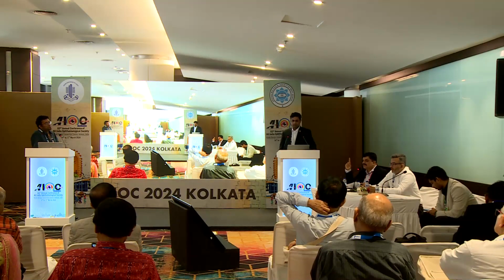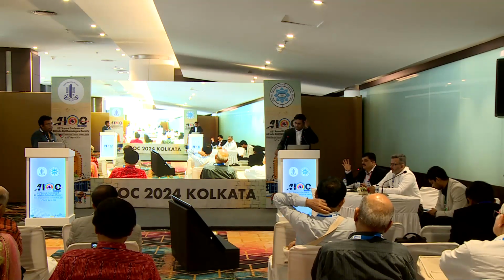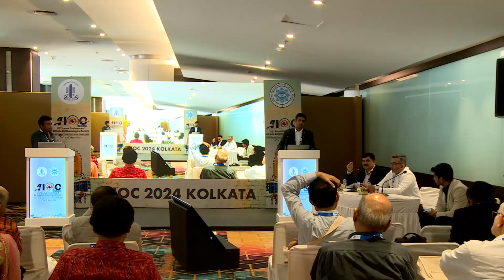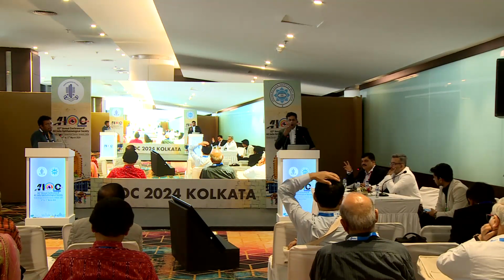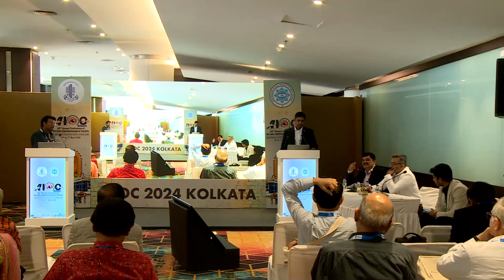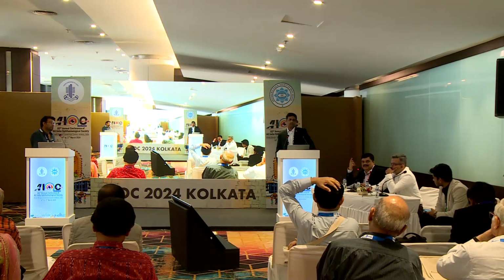Actually, I had a patient with a toric trifocal I had done, a patient with very high myopia. The biometry was perfect, but after putting the lens, it rotated within the bag. Then what I did normally, like what David Chang says, is keep the patient for 1 hour, then get in front of the slit lamp again, see, and rotate. I rotated, then called the patient after 1 week. Again the lens rotated. Then I took the patient back into the OT. Then again it had rotated, by another 1.5 cylinder.